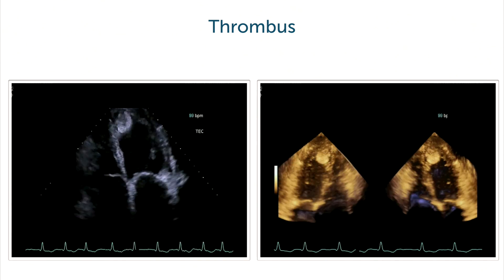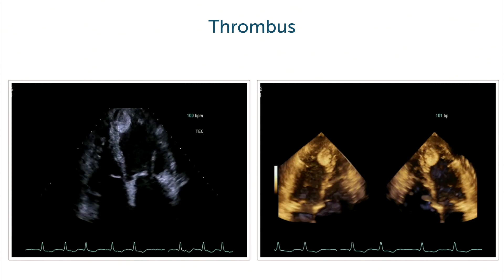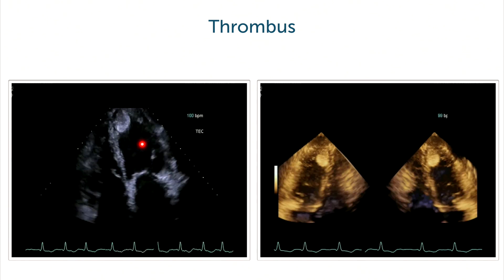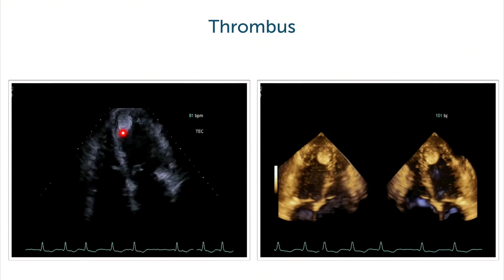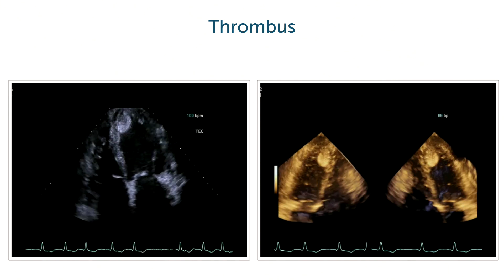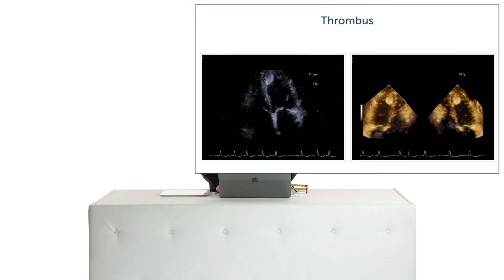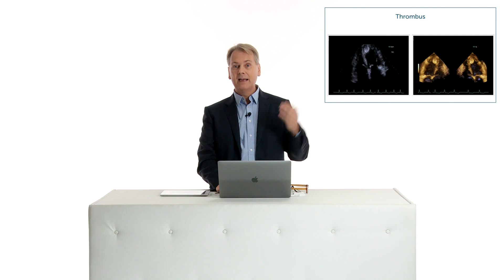Of course, when it comes to detecting thrombi, you do see them in 2D very nicely, as here for example in a transthoracic echo. But it is always nice to display that in 3D, and to communicate that also with the referring doctors. It might not really have any impact on the way we manage this patient, but I do believe that it's a very nice way of additionally displaying such a thrombus.